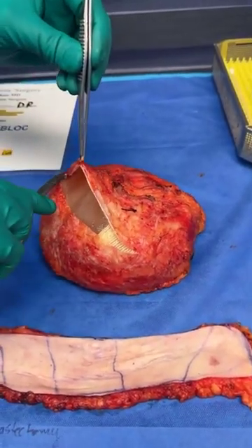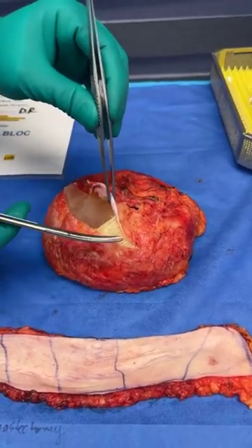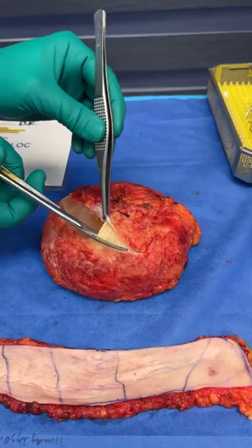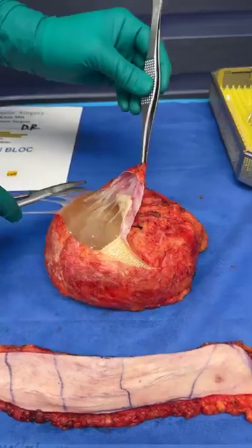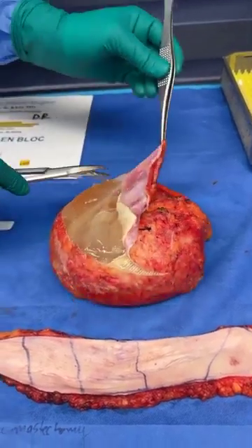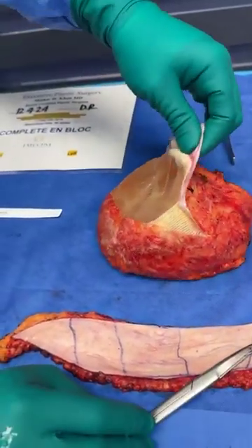And this lady from Texas, 64 years of age. Look at this. Look at this cloth-type mesh. I don't want to cut that, so let's see on the inside. All done en bloc, remember, the gold standard. Someone said, why do you have to do an en bloc on everyone? Well, this is just a 10-year-old set of implants. I'll tell you, this is why you do the en bloc.